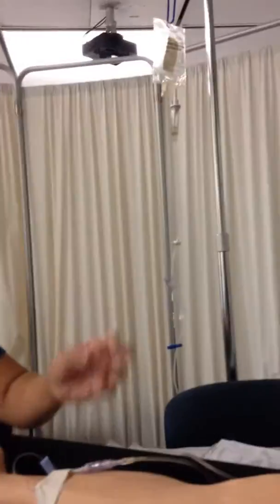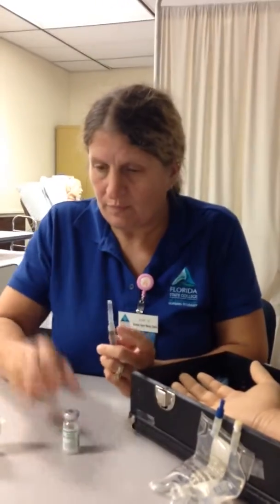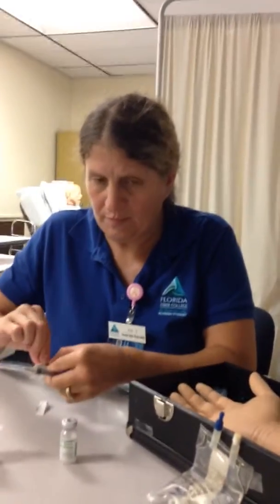Side effects include dizziness, seizures, meningitis, encephalopathy, optic neuropathy, and rash, and of course allergic reaction to the antibiotic. But the patient has stated that he has no allergies. He's got normal saline running for his dehydration. So now I'm going to clean off my Flagyl, and I'm going to pull up 2 milliliters to insert into my mini bag.